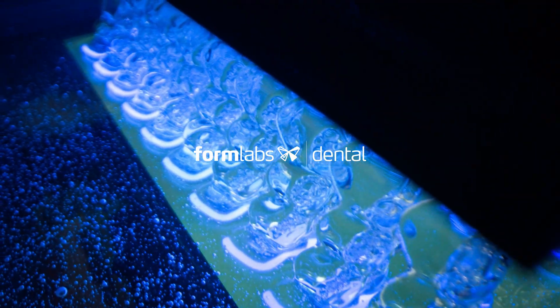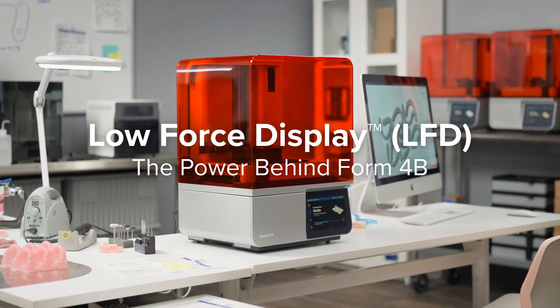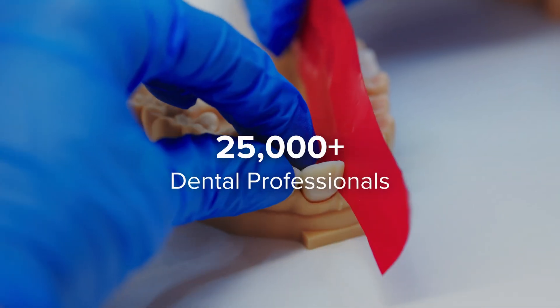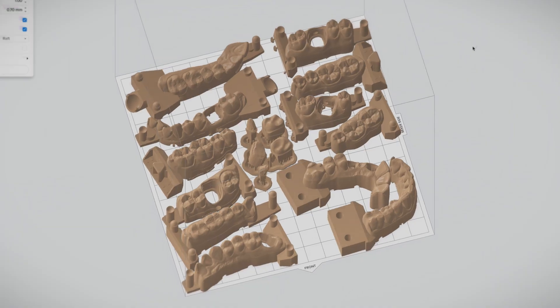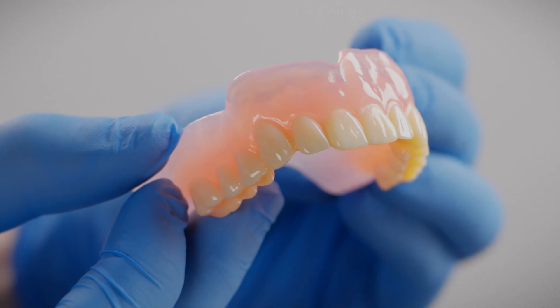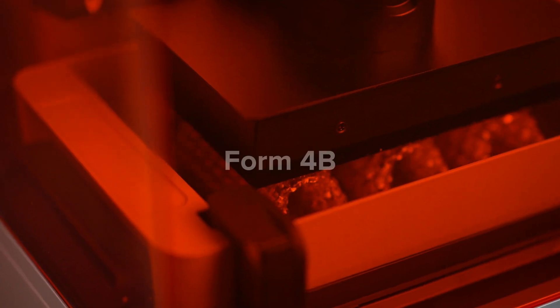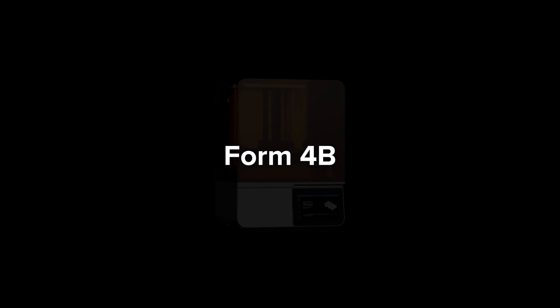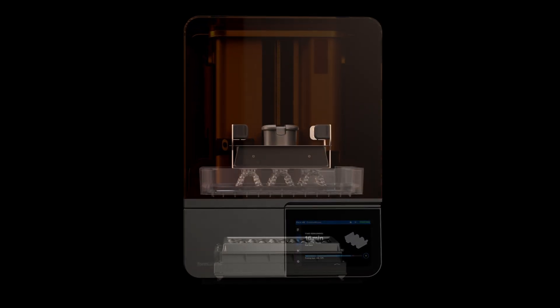Introducing our low force display print engine, the power behind Form 4B. Since 2011, over 25,000 dental professionals have relied on Formlabs SLA 3D printers to produce over 15 million dental parts. Now we're pushing the boundaries of industry standards even further with Form 4B, for a perfect balance of speed and accuracy that's unmatched by any other technology on the market today.